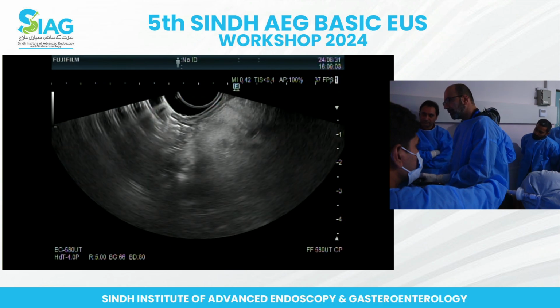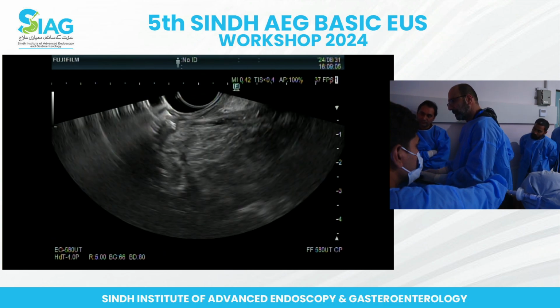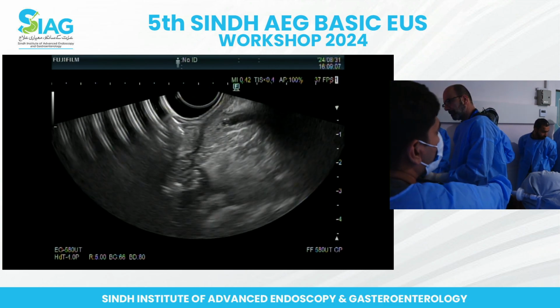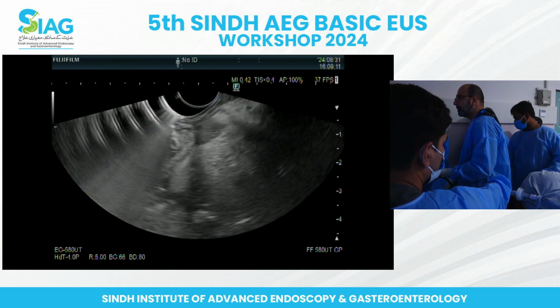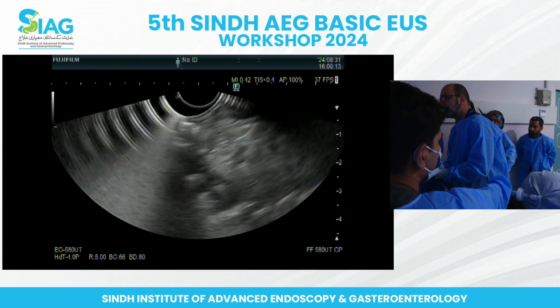It's right close to the bile duct. But if these biopsies come back negative, I would do ampullary biopsy. We can see if we can get some right now.